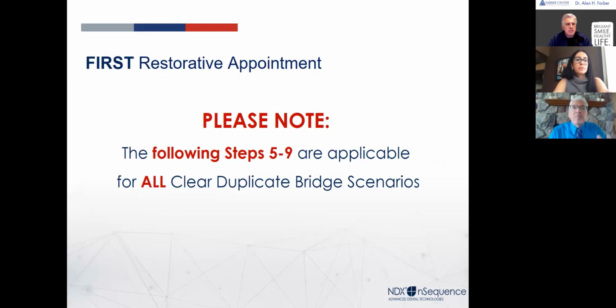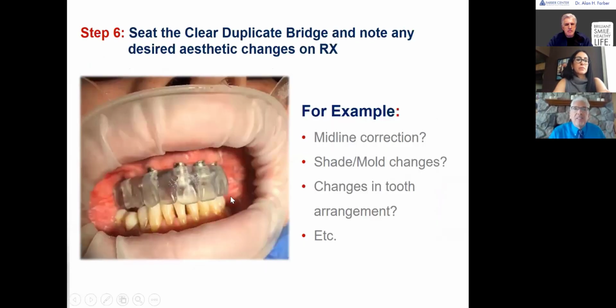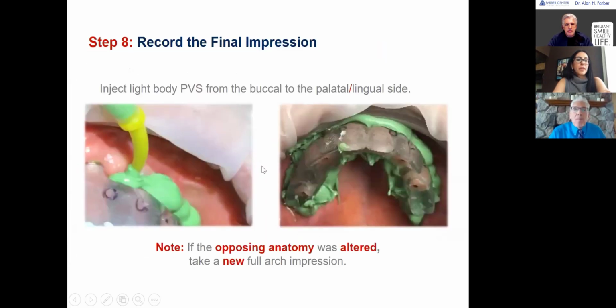So now you're just going to do the same thing you did before, which is create some gaps. So take it out, create a gap, and then you're just going to take a bite, and you're going to take a final impression because we created a gap. What you did before with the impression material was not an impression. That was just a jig to position it. So we still need to get our final impression. Again, my friends, that doesn't happen very often, the other scenarios I just showed you. So I just wanted to show you another way around this.